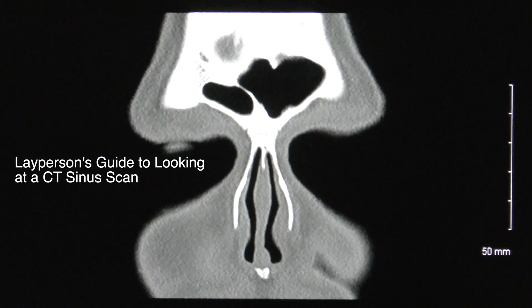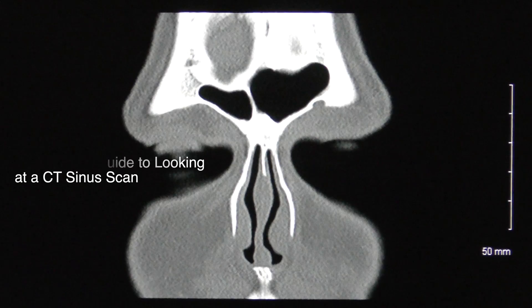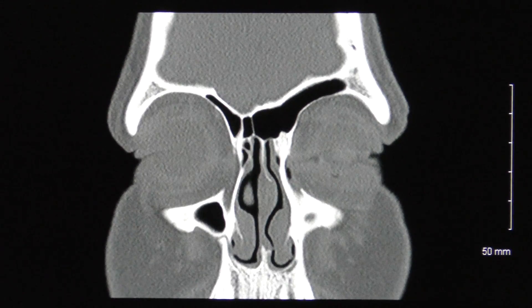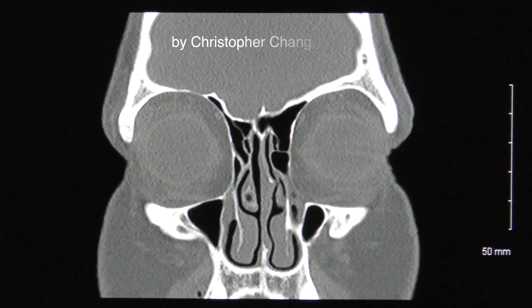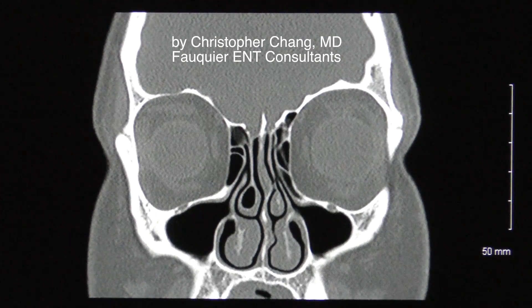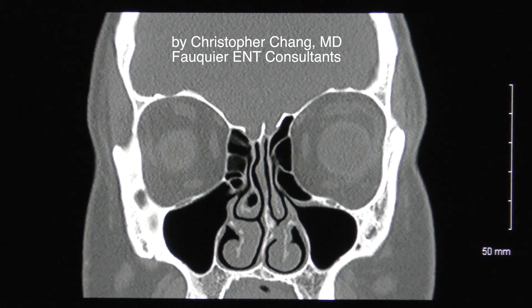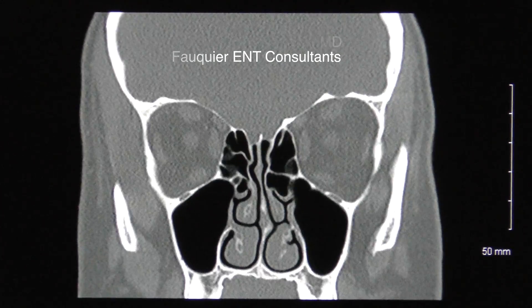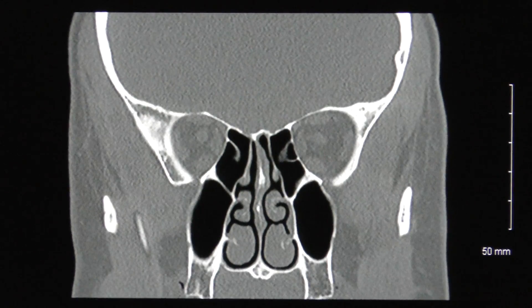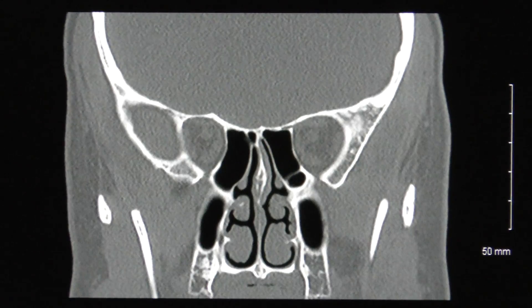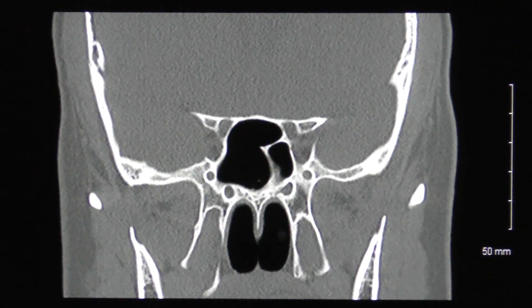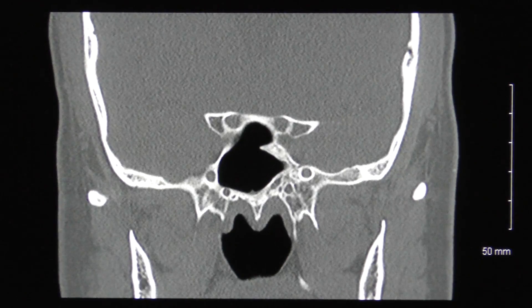It is now possible for patients to easily obtain a copy of their CT sinus scan and view the images on their home computer. However, the images may be confusing without an explanation. But the good news is that CT sinus scans are actually easy to understand once you know what is going on, even for a patient without any medical background.